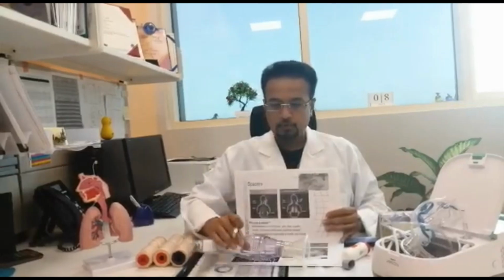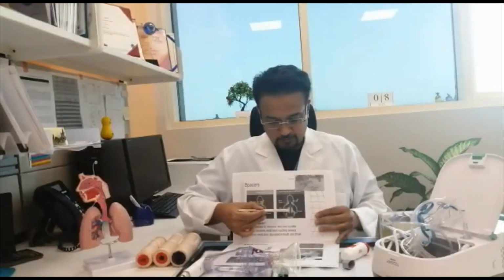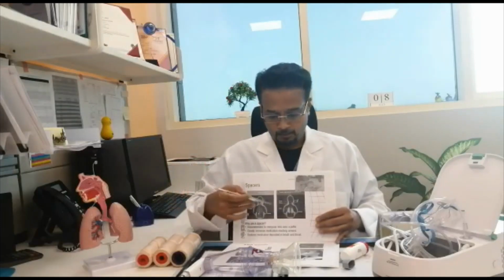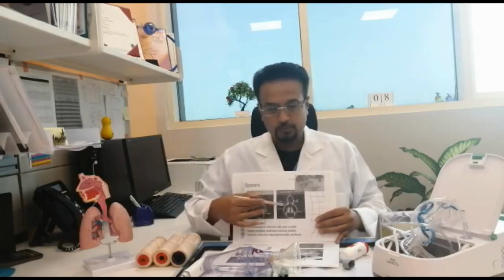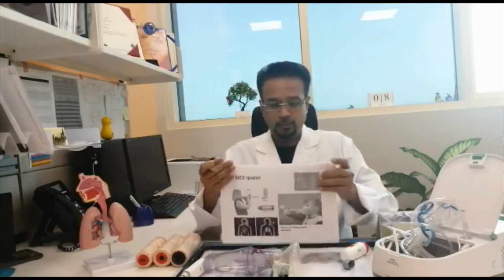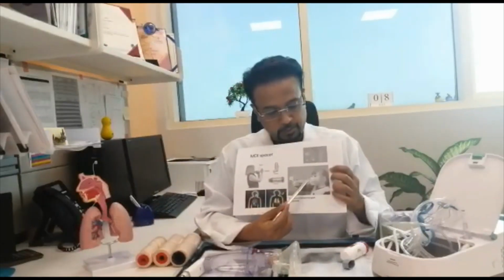So if you use the medicine with the device, the medicine is getting deposited mainly in the lungs so that it doesn't go anywhere else, so that the child doesn't have any systemic effect from the steroids. So the benefit of the medicine goes completely to the lungs only. So these are the various methods of how you can use it with the child, with the face completely covered.